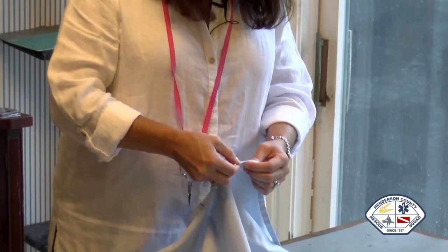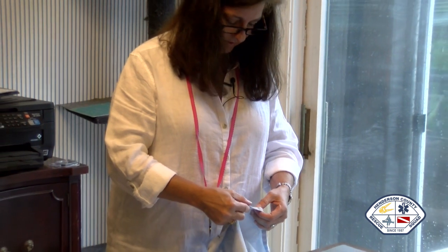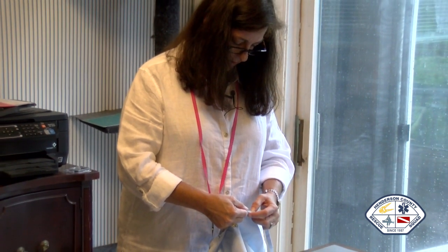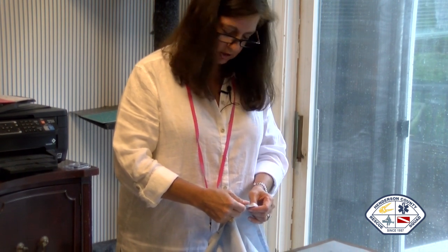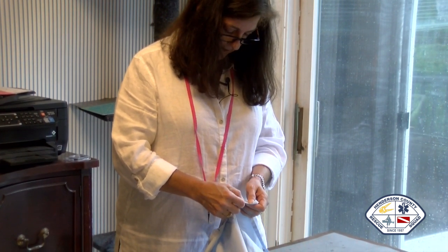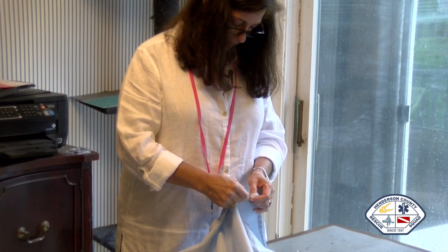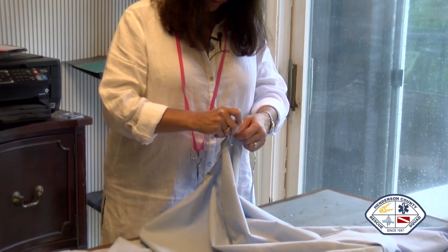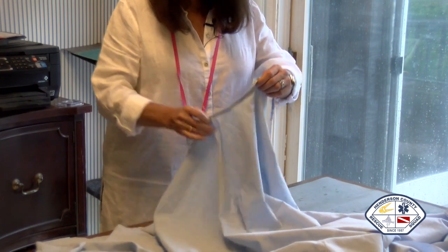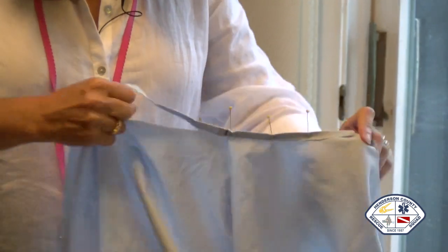And these I found in the linen closet, and I'm pretty sure they were mine when I was a kid, maybe my brother's. So they're really super soft and super clean. I washed them in bleach, and they did not fade. They didn't discolor. Those are the kind of things we need, because things are going to be washed in bleach. So I've pinned half of my neck with the bias, and I'm going to ultimately zigzag that on.